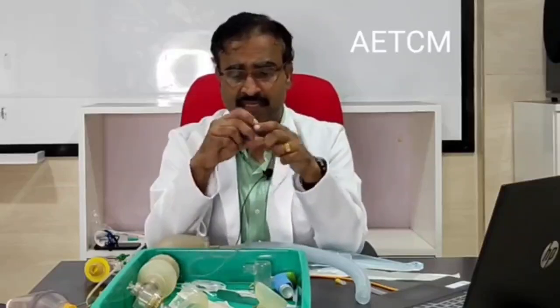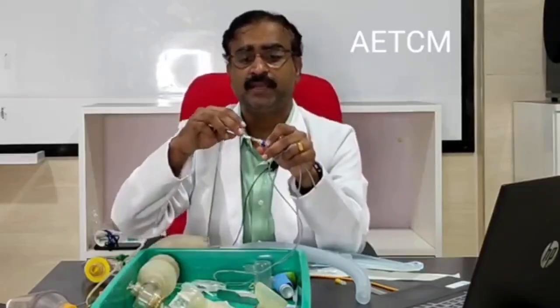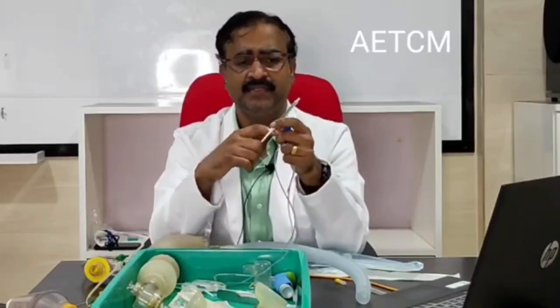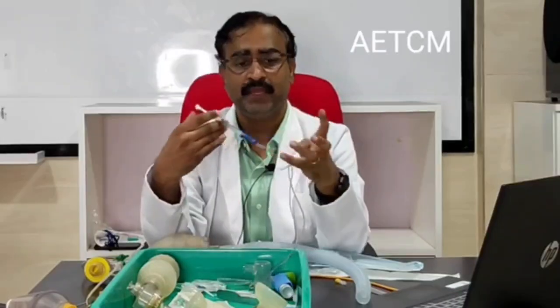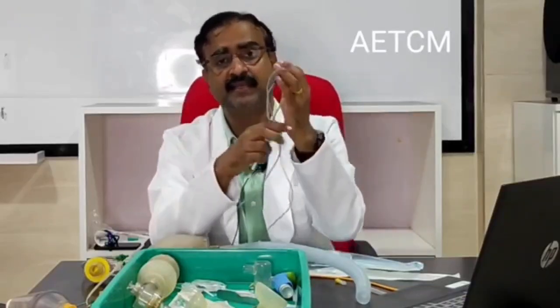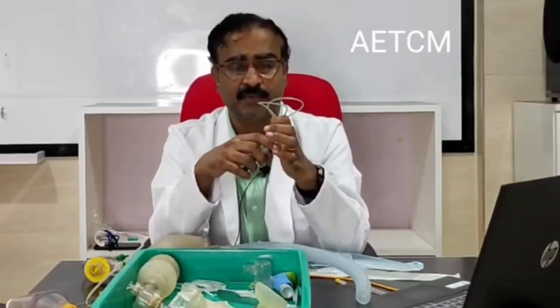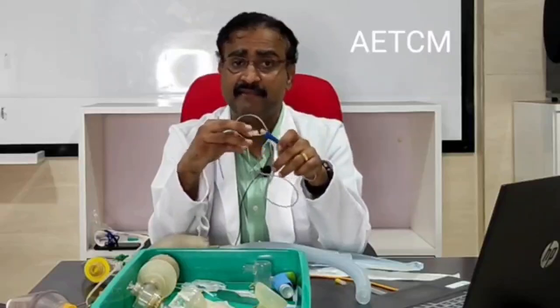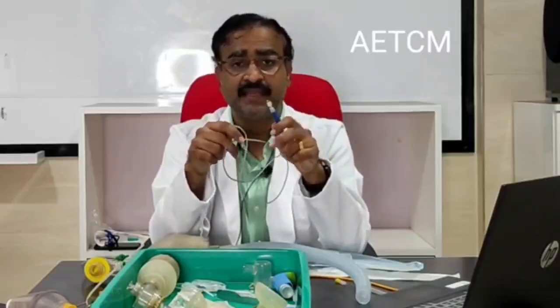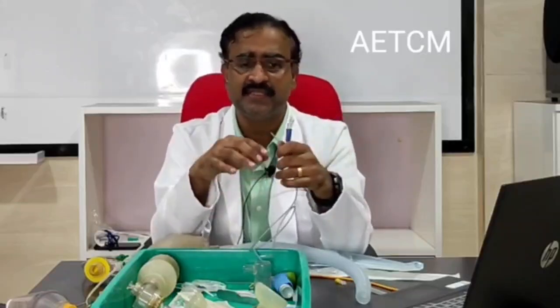The other way to confirm whether this has reached the stomach is to take a syringe and you keep it at the proximal end of the catheter. Okay. And then you just insert around 1 or 2 ml of air very quickly, and as you do so, you auscultate on the stomach end, and then you will find a gush of air that actually is released inside the stomach. So this is how you identify if you are inside the stomach. Like I said, the gold standard to identify if we are in the right position is by getting the X-ray done radiologically, right? Okay. So these are the uses.